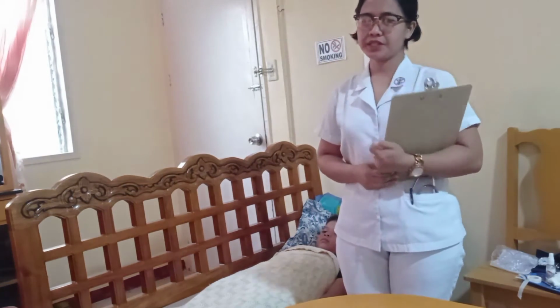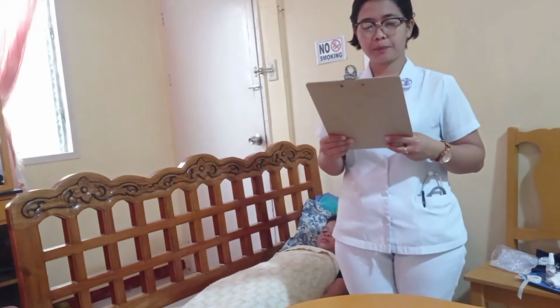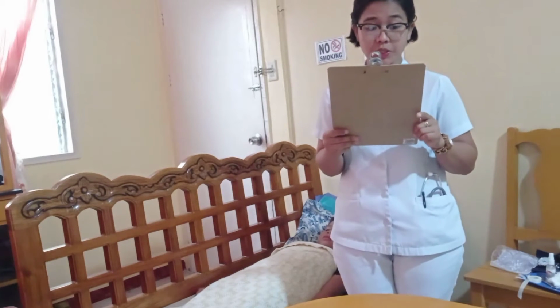Good day. I am student nurse Esther Baguio and I am going to perform an oxygen administration. So now, first, in preparation, I am going to determine the need for oxygen therapy and to verify the doctor's order for the therapy.